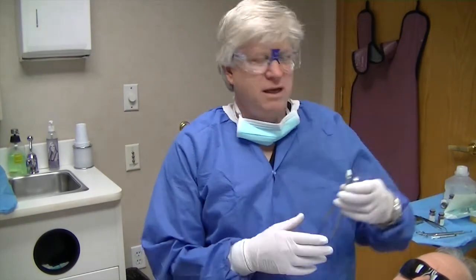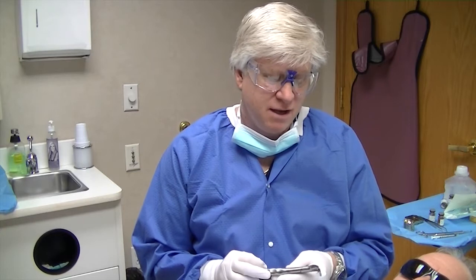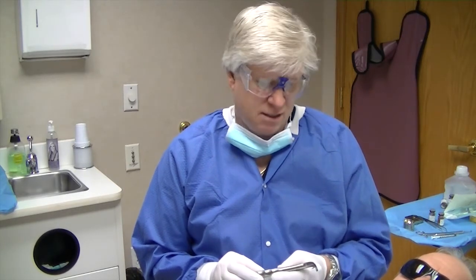Hi, I'm Dr. Tim Kaczynski, and today we're going to demonstrate the use of the innovative Golden Physics 400 series posterior forceps. We're going to be removing the mandibular second molar tooth, which had been endodontically treated and was determined to be non-restorable.